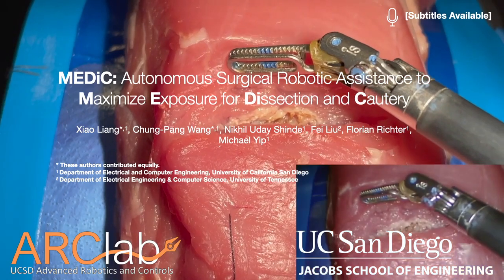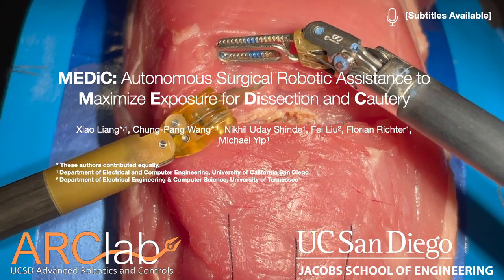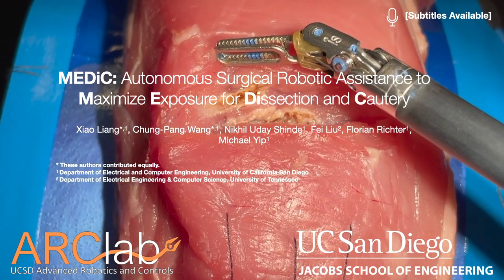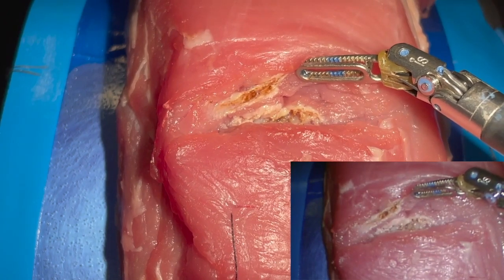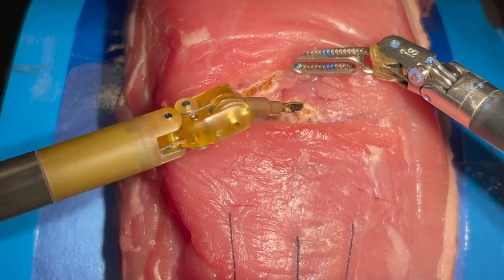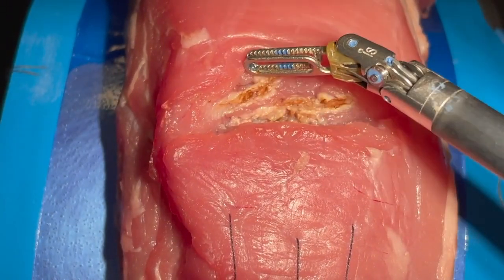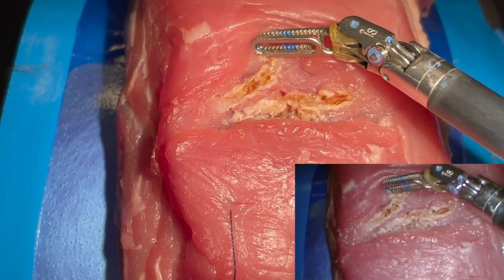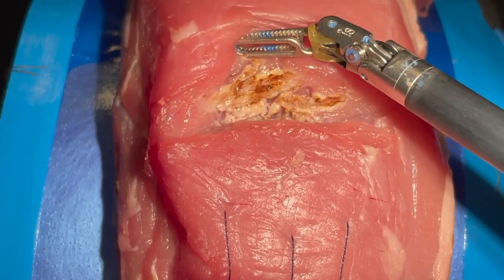We present MEDiC, an autonomous surgical robotic assistance system designed to maximize exposure for dissection and cautery procedures. Shared surgical automation has the potential to alleviate strain on healthcare systems. We focus on one important skill within surgical shared autonomy, automating robotic assistance to maximize visual exposure and apply tissue tension for dissection and cautery.